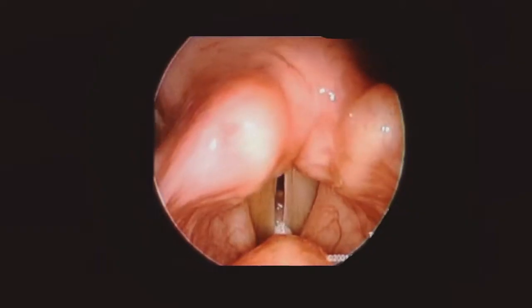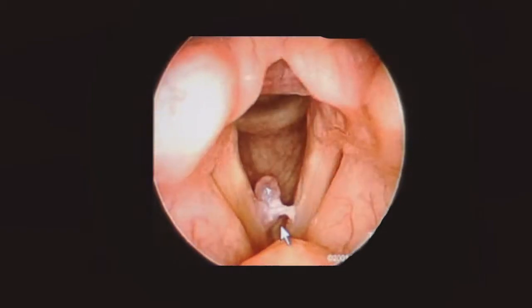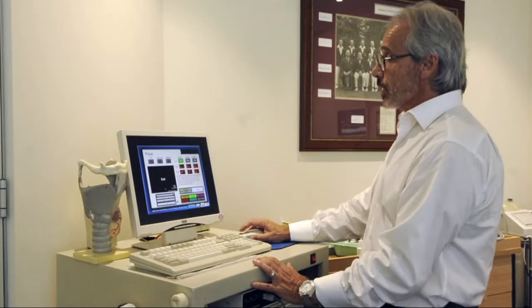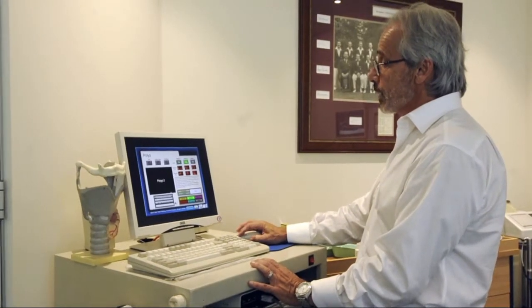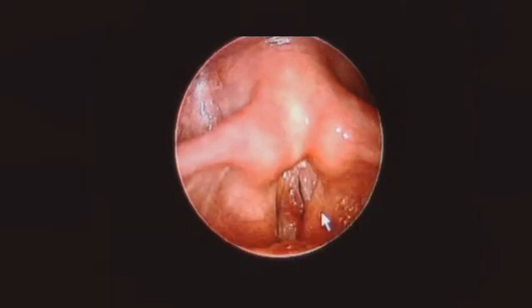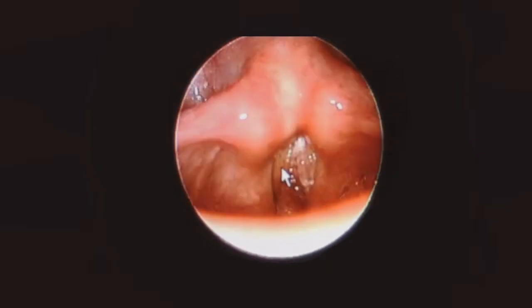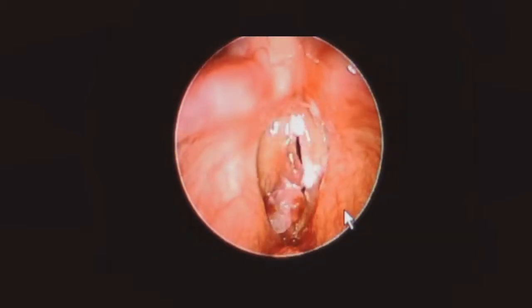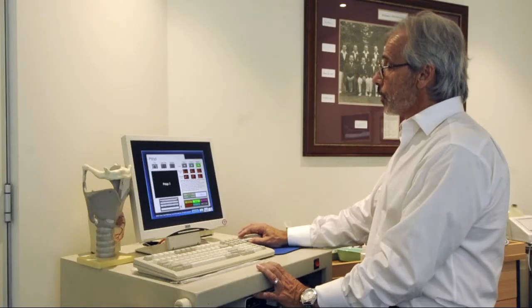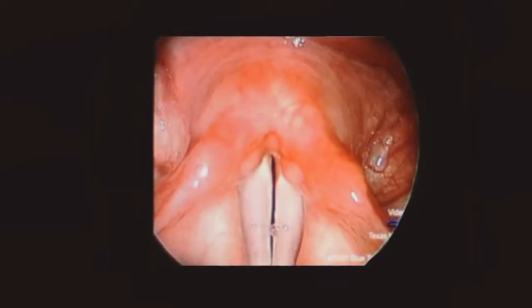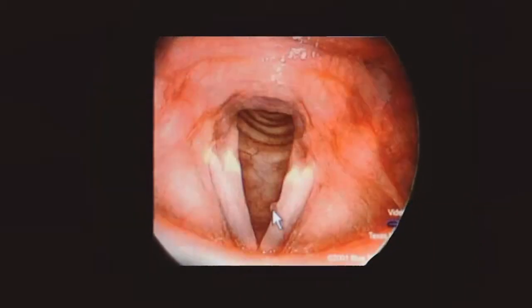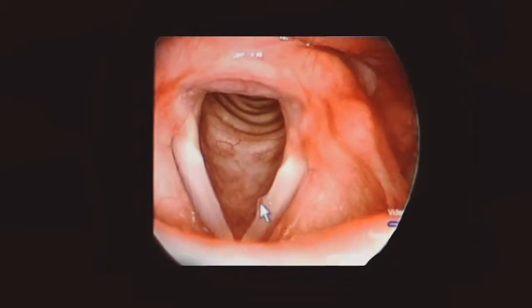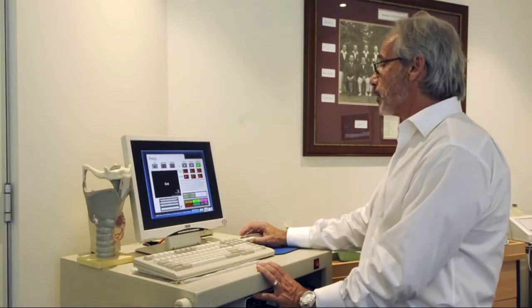Vocal fold polyps are usually due to voice abuse and/or reflux. This is a large pedunculated polyp which has had bleeding to it and is associated with gastroesophageal reflux. In patient two, we demonstrate an even larger polyp on the cephalic margin of the vocal cord. These lesions are appropriately treated surgically with appropriate histopathological evaluation; a variety of microsurgical techniques is available. This is a much smaller vocal fold polyp seen in a professional voice user after a vigorous performance — this polyp, with conservative management, will involute.